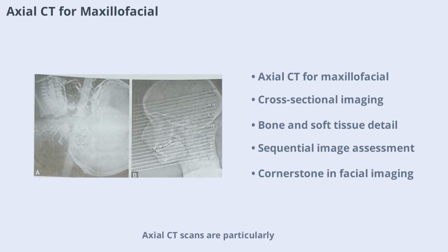Axial CT scans are particularly useful for imaging the maxillofacial area. These cross-sectional images provide detailed information about the bones and soft tissues of the face, aiding in the diagnosis and treatment planning for various conditions. The ability to obtain sequential images allows clinicians to assess the extent of lesions and anatomical relationships with precision, making axial CT a cornerstone in maxillofacial imaging.